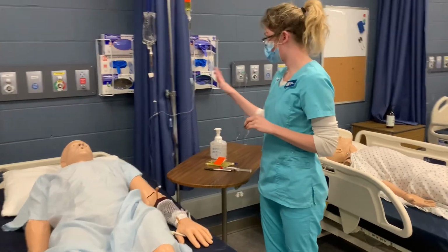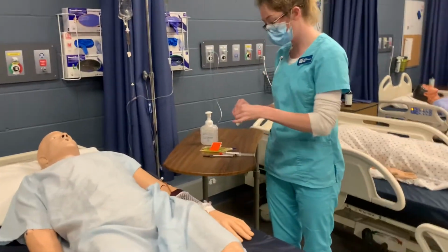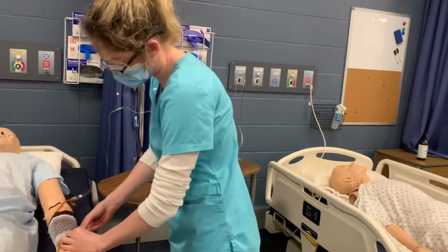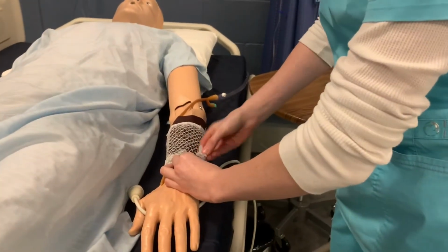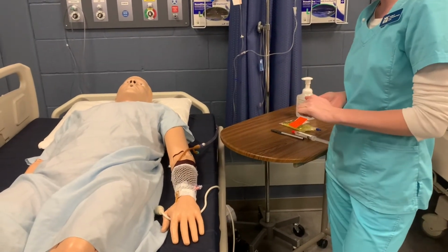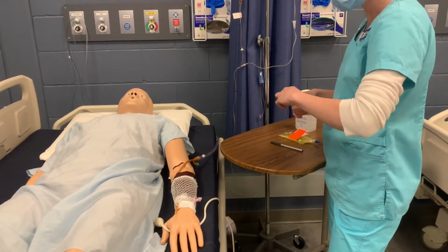Now that I know that all the IV equipment is in tip-top condition, I'm going to sterilize the Luer lock and then flush. I'm going to wait for it to dry, and it has dried now.